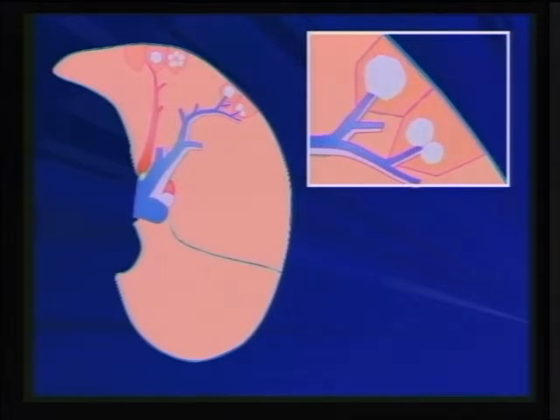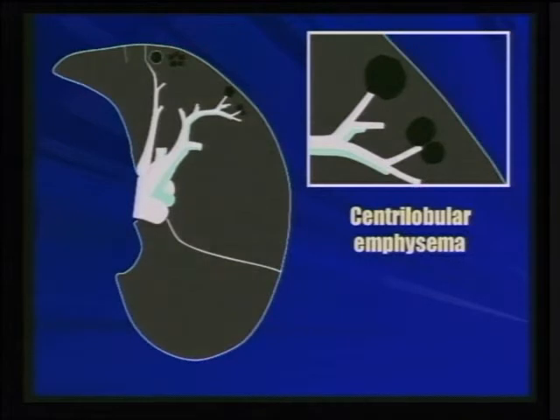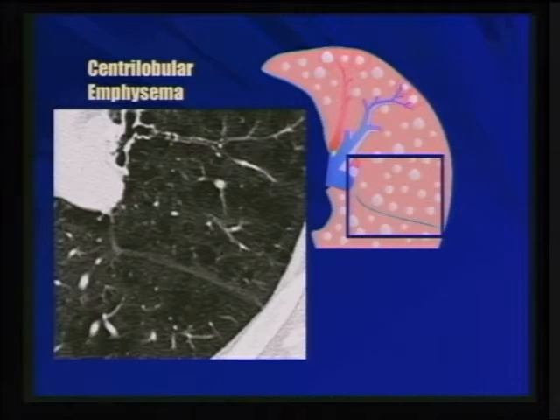It has a tendency, while it expands the secondary pulmonary lobule, to respect its size, but more importantly, to respect the orientation and the position of the core structure, which is the central arteriole and the central bronchiole. So I'm going to show you some examples of that. And this is a good example showing the areas of decreased opacity, and here's a secondary pulmonary lobule here, but you can see that the central arteriole is still within the confine of the secondary pulmonary lobule.